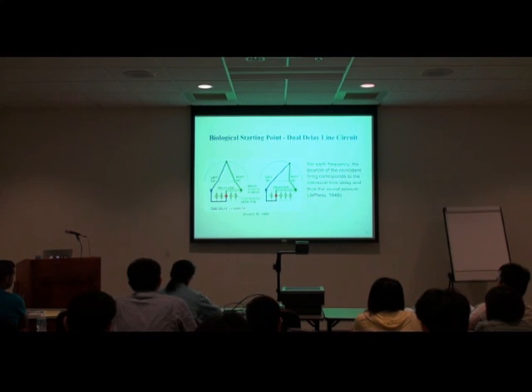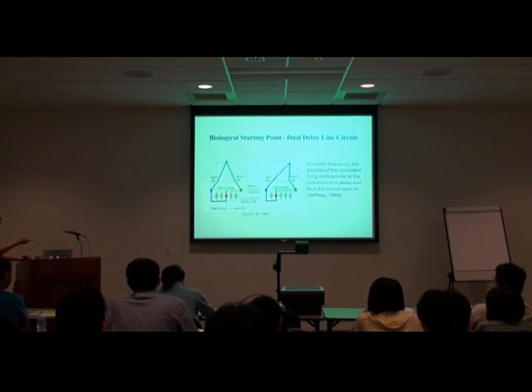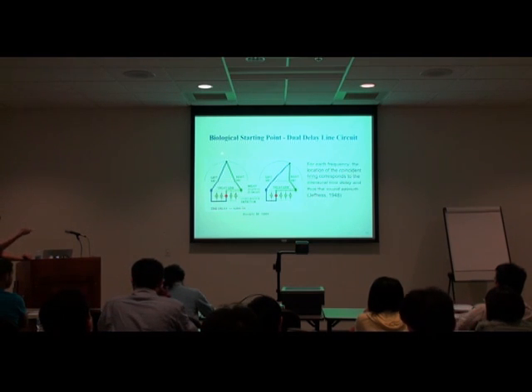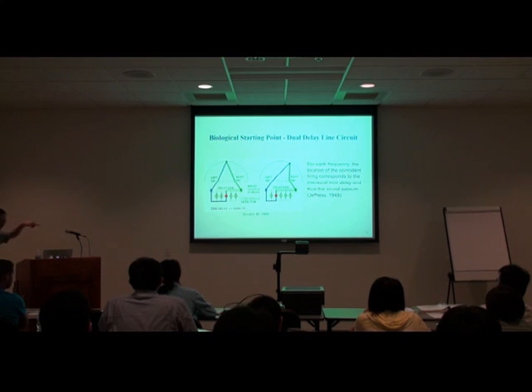So let's go back to the biology again. From various evidence that we have seen, the brain has this unusual circuitry, and this is called the dual delay line. So the output of the 2 ears, let's say this is not microphone, this is ear, left ear, right ear, is first transmitted to a structure called the cochlear nucleus.